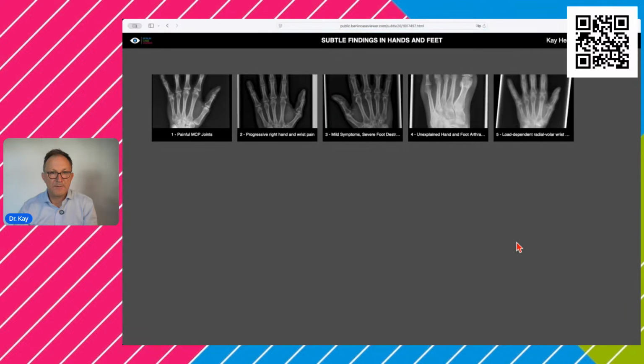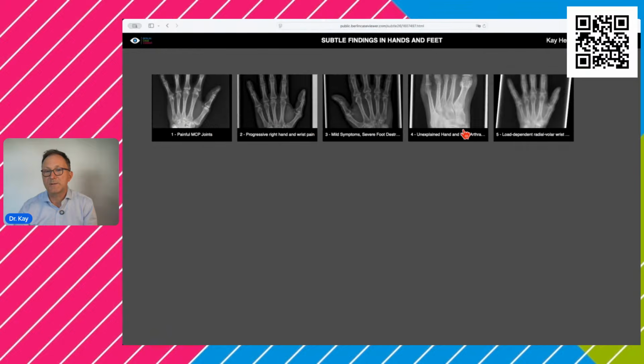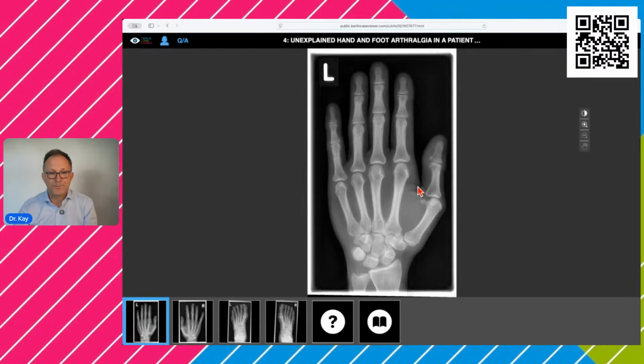All right, already the third case. And now we can go to case number 4. And before we do that, I need to check how many of you are in fact on the platform. We have 10 people who have logged in. So we can expect some answers now. All right, let's start with case number 4.